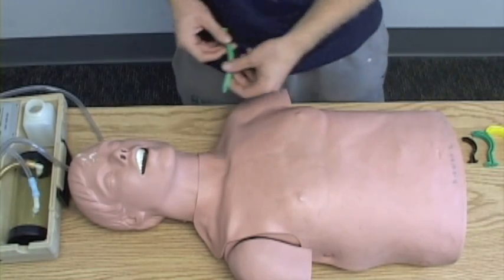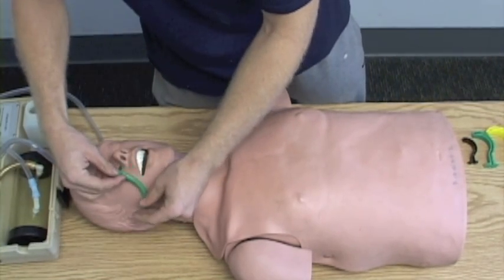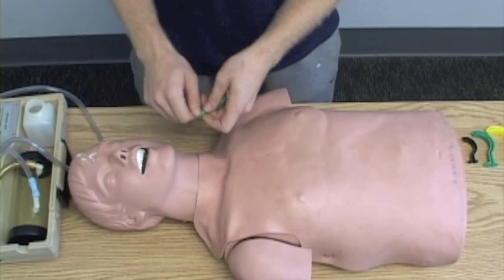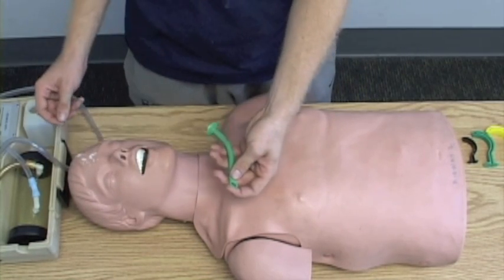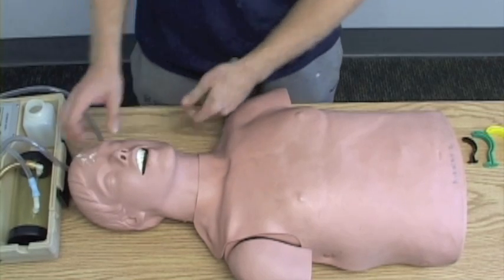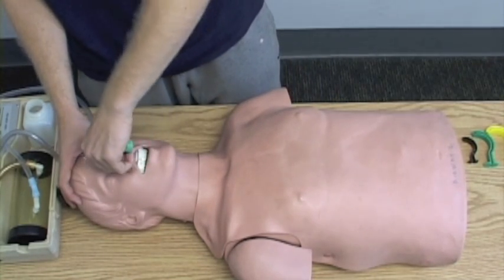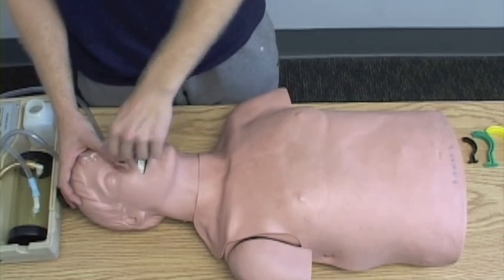Insert nasopharyngeal airway. I'm going to measure the nasopharyngeal from the tip of the ear to the nose, to the nostril. I'm going to lube up the NPA, lube the nose. Insert into the right nostril with the bevel facing towards the septum.